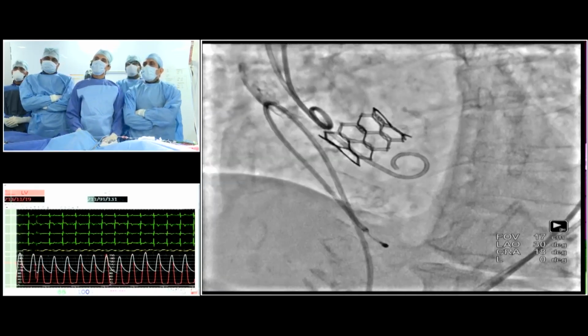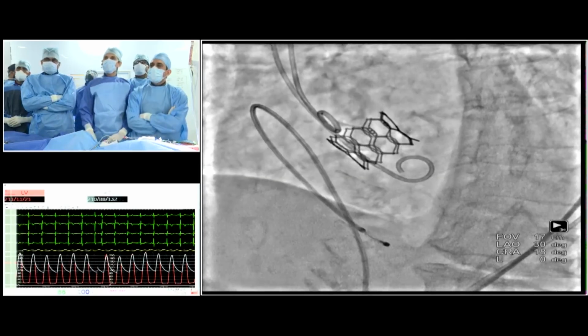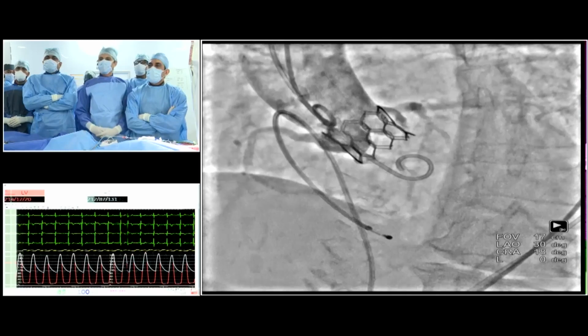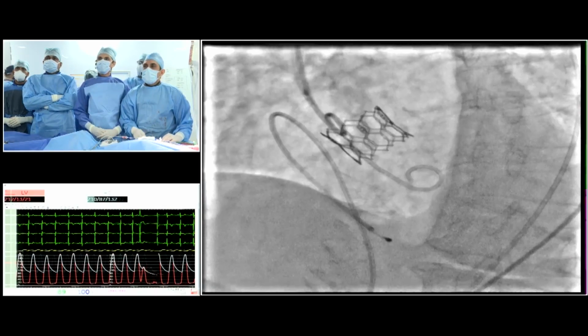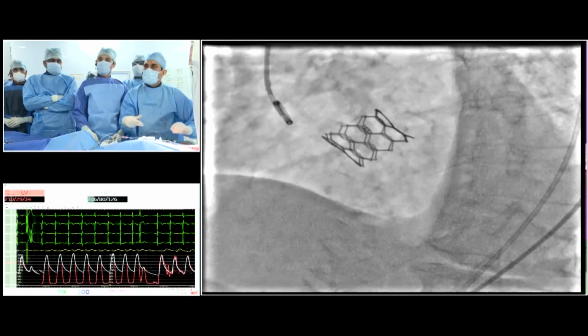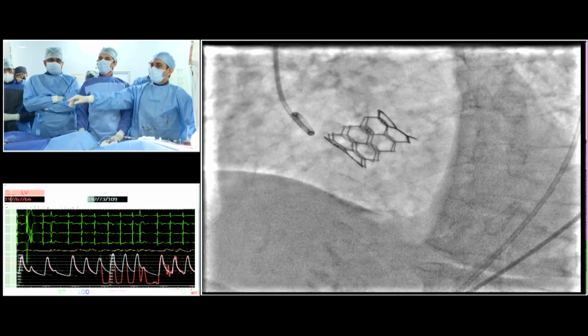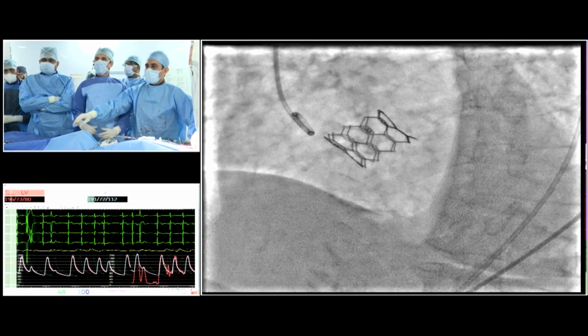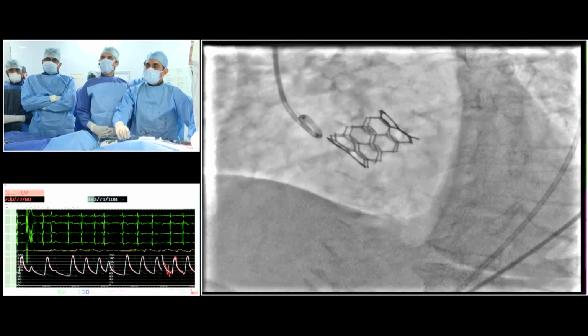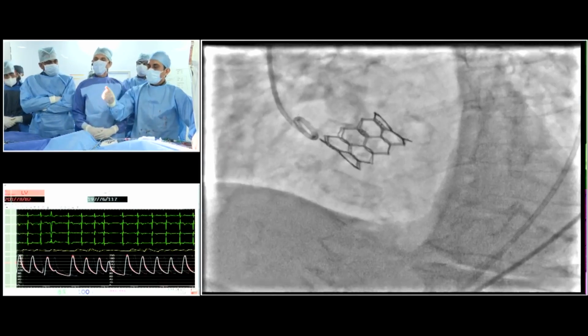So the left main is flowing nicely, and you can see big tail into the valve, I mean, zero regurgitation, good access to the main stem. And then I'll remove this thing, and we'll take one more picture just to make this statement. India can be very, very proud to have created that technology. There's no doubt about that. Very impressive.